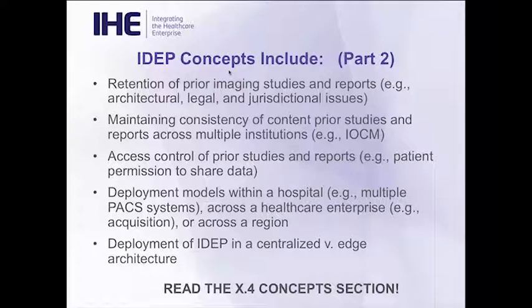Another example is a regional or health information exchange type example where hospital systems within a certain region have agreed to share radiology studies. In addition to that, from a technical point of view, you can also look at IDEP deployment as centralized or as an edge architecture, and that's something that we'll get into in the following web sequence diagrams.